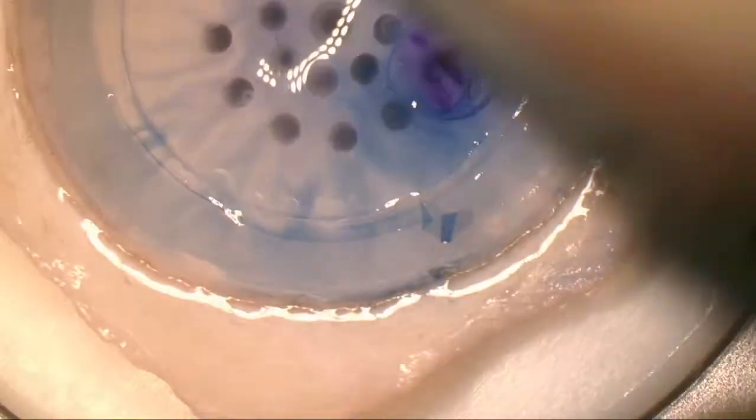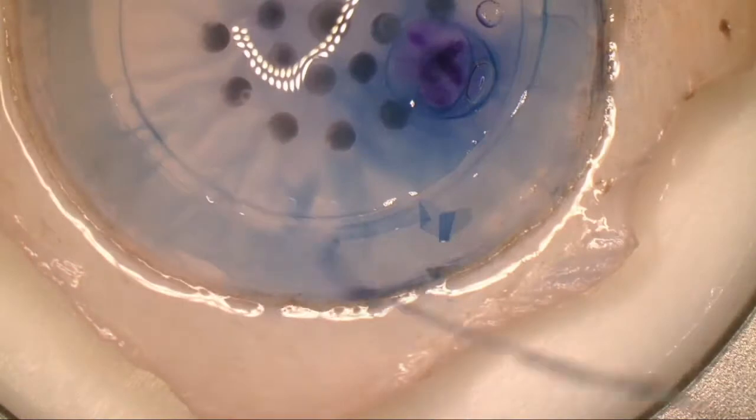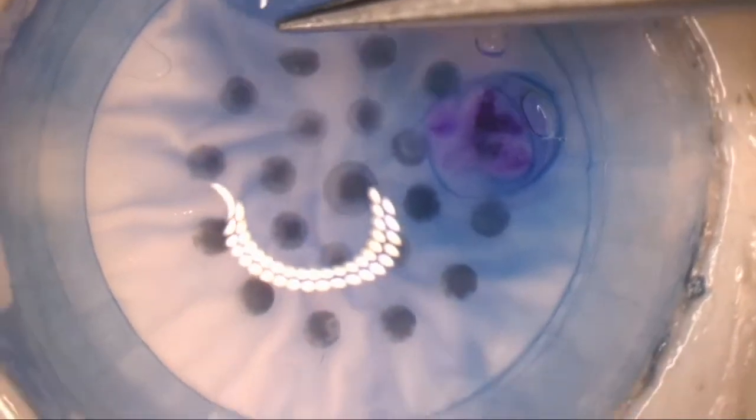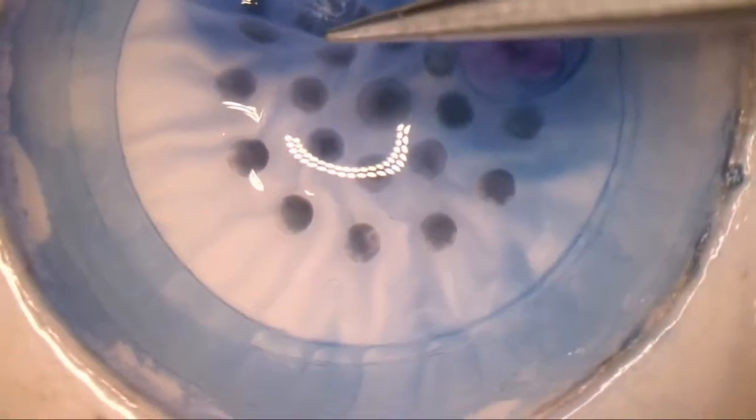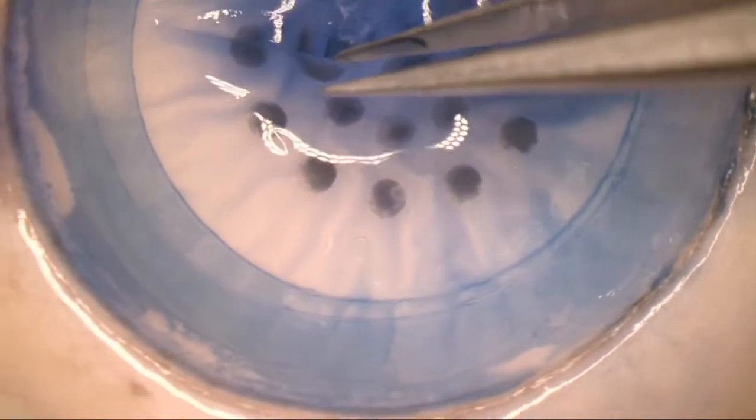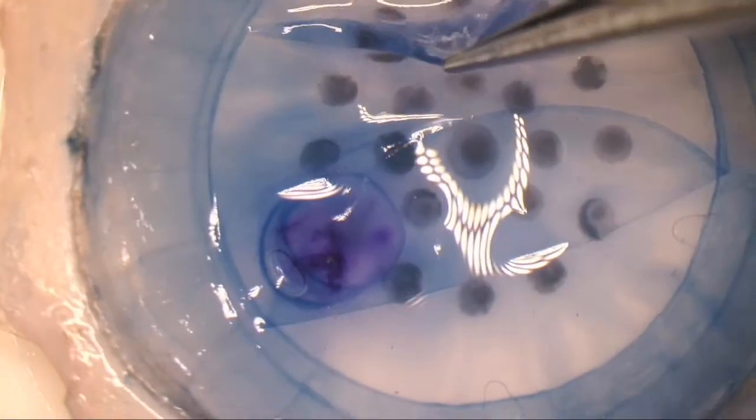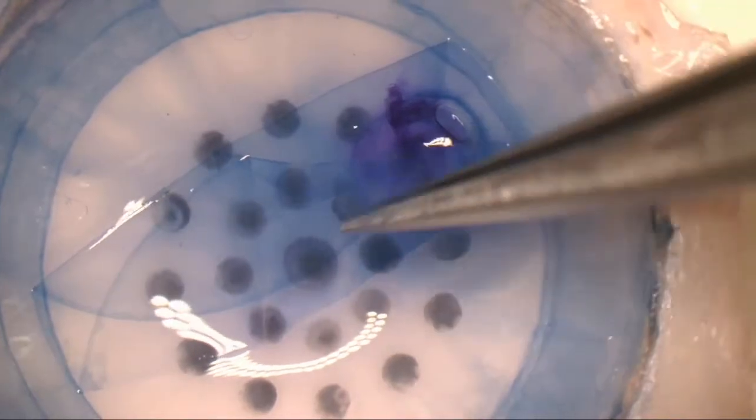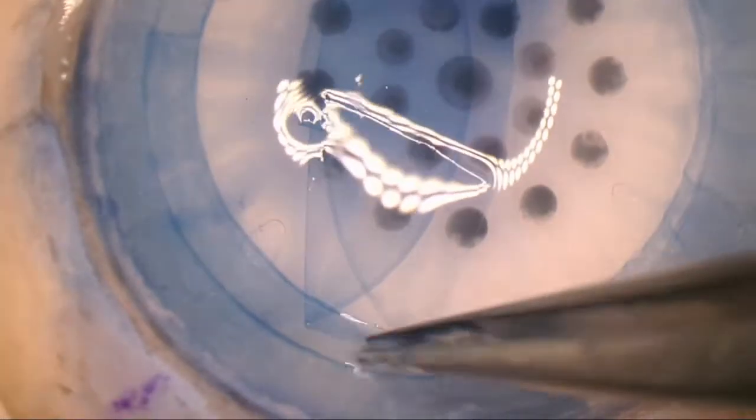The donor tissue in excess is removed and staining with trypan blue is repeated. Then, the DMEK graft is trifolded with the endothelium inwards. This prevents possible damage to the endothelium from contact with the cartridge wall. Most importantly, folding the tissue against its natural tendency to roll with the endothelium outwards makes it unfold spontaneously during delivery.